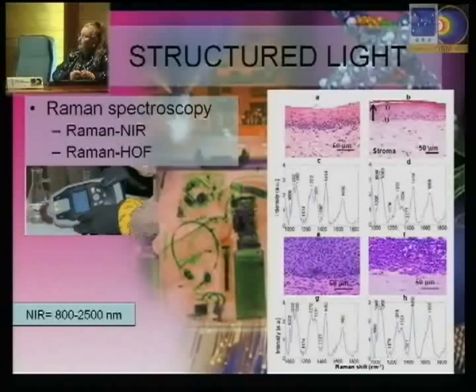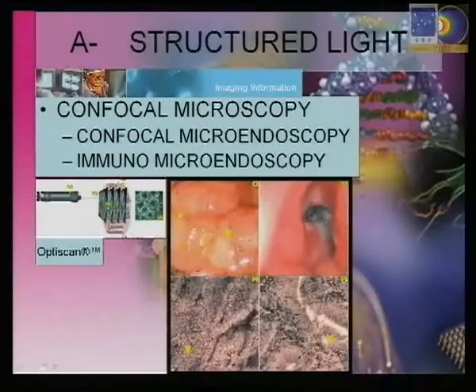And this is what we have mentioned previously, that probably in order to select, in a screening of the slide, areas which are suspicious, it will be better to think of spectroscopy than of artificial intelligence in order to identify the type of cells according to the pathology criteria.